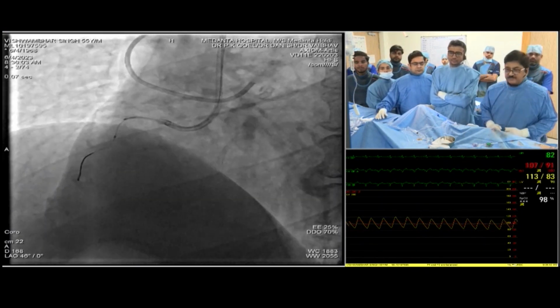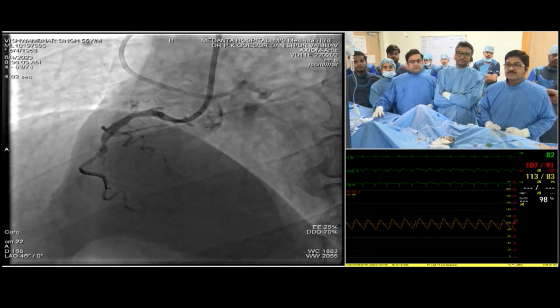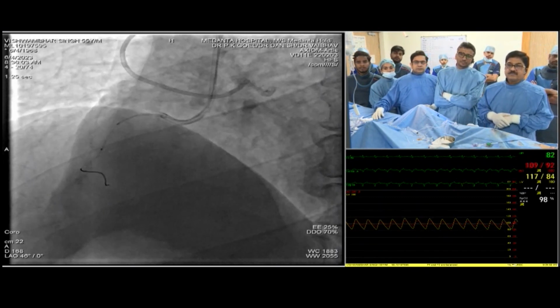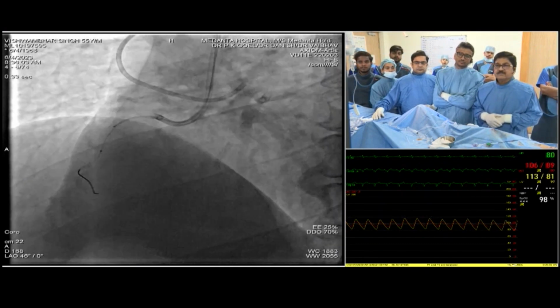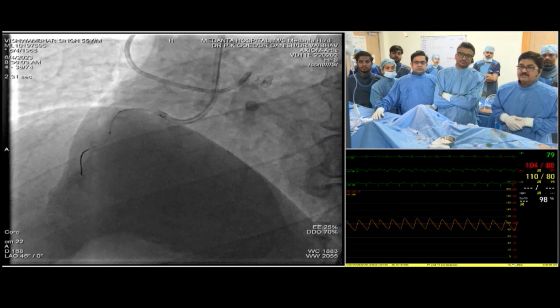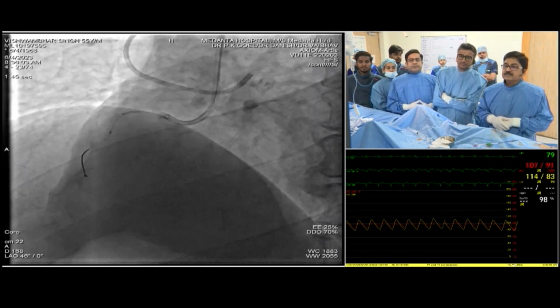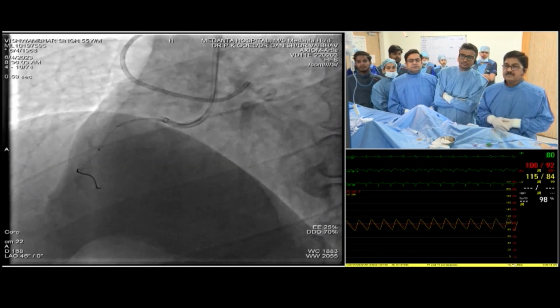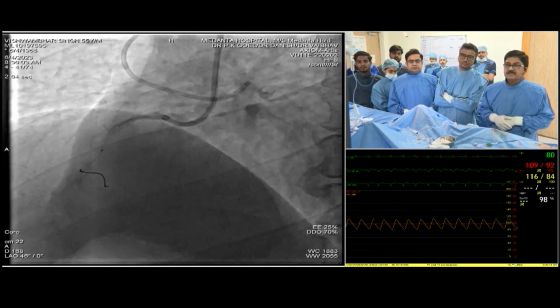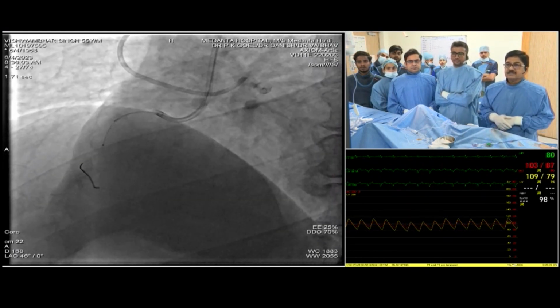Okay. Dr. Nagamatsu, if you see this approach of this case, with the side branch there and a possible bridging collateral, how do you approach this case? Okay. Anyway, we need more information. We still doubt whether this route is in the CTO or a bridge. Maybe the CT angiogram can give us good information on whether this route is outside of the vessel or in the CTO lesion.